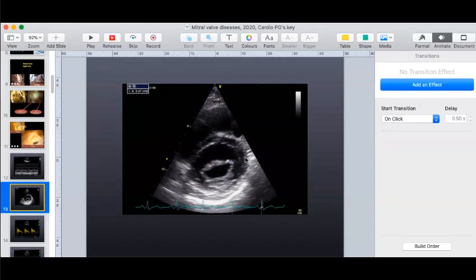Echo dropout, okay. Apart from that, any other comment? So, valvular thickening, it is there. Sometimes that can overestimate them. Valvular thickening. Okay, so what you can do is you can put it in a better way. So you can say that the mitral valve, as it approaches towards the smallest orifice, it is funnel shaped.